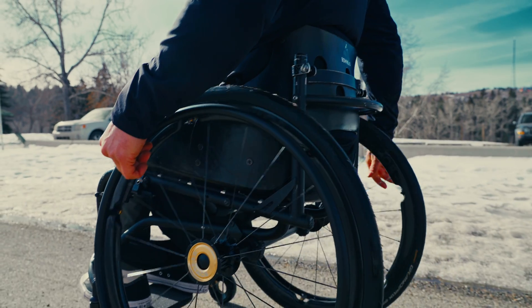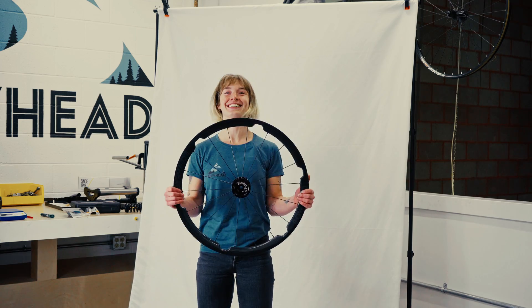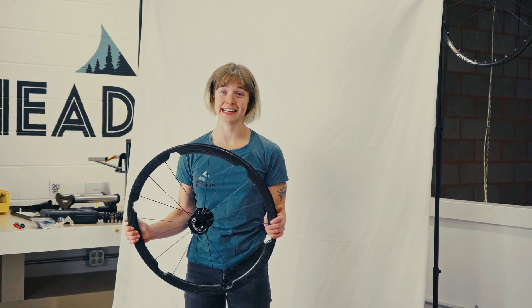So without further ado and without any more punny spokes, let's dive in to the key features that make this wheel so unique. We have a precision advanced carbon fiber rim that's built to the highest quality standard. They are the perfect blend of strength and agility. Throughout the design, our 559s underwent rigorous testing.